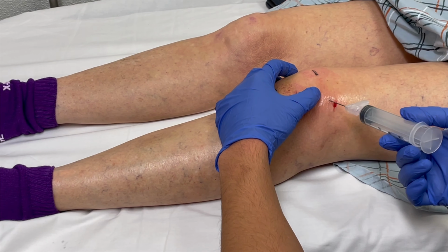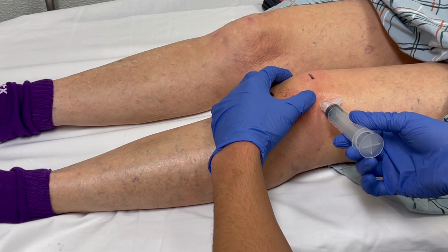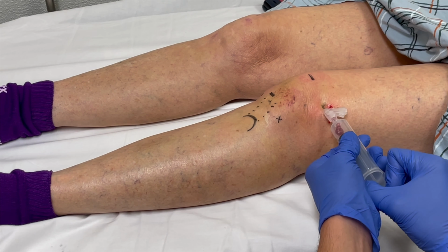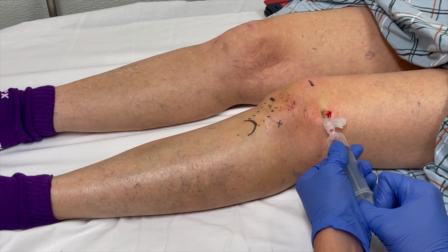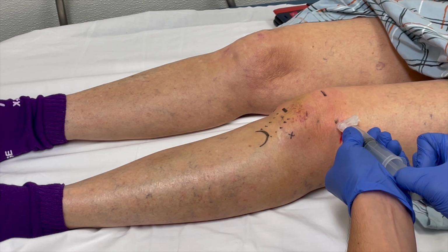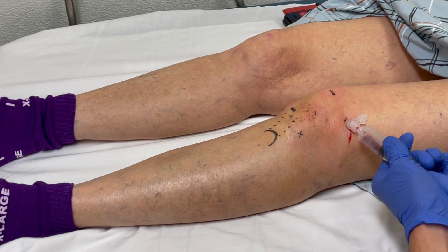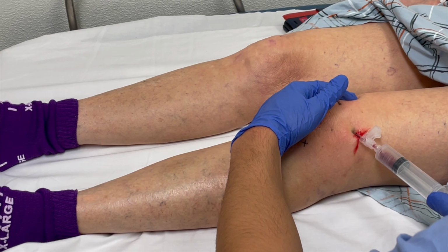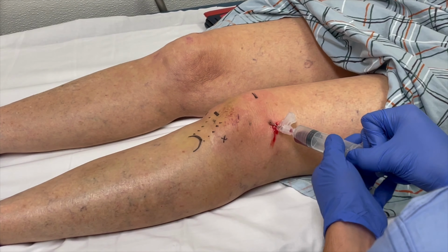It is helpful to move the patella over laterally and then to slide the needle underneath the patella between femur and patella to ensure you are in the knee joint. Begin your aspiration, and it's very common to require some mobilization of the needle as soft tissue can block the needle portal. Again, a helpful tip is to milk the medial side of the knee to push the effusion into the suprapatellar pouch laterally to aid in your aspiration.